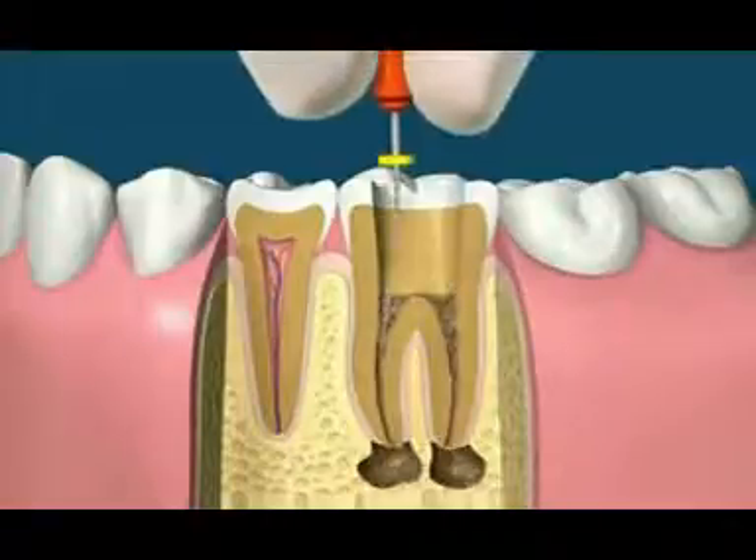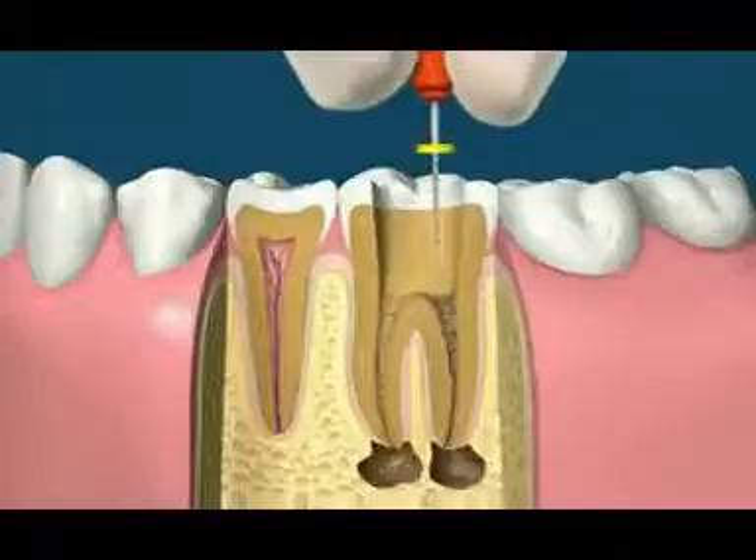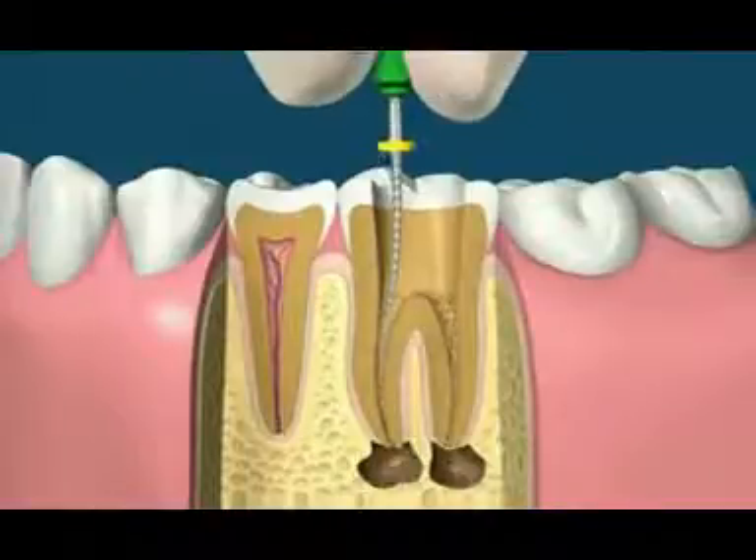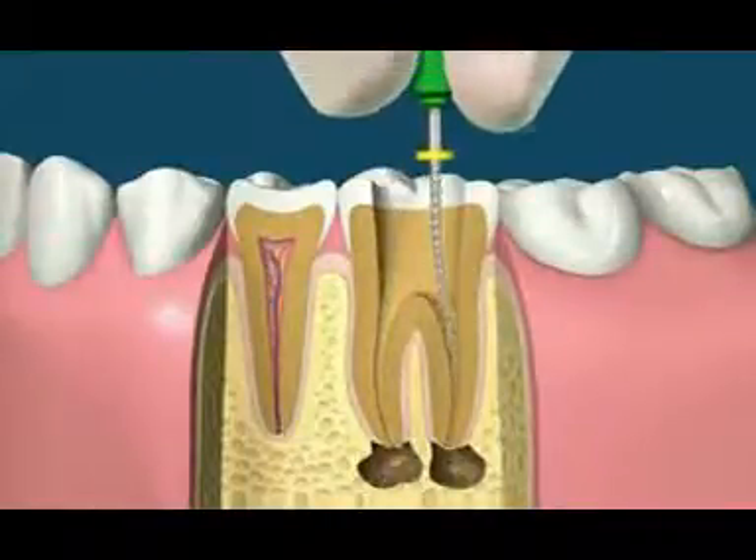Tiny files are then used to remove the contents of these canals. The manual method of root canal treatment involves using increasing file sizes that gently clean and shape these canals. A tooth may have one or more canals.